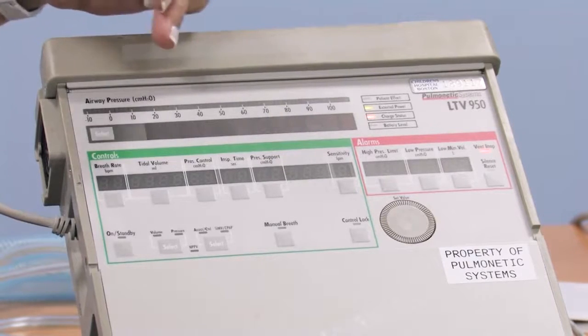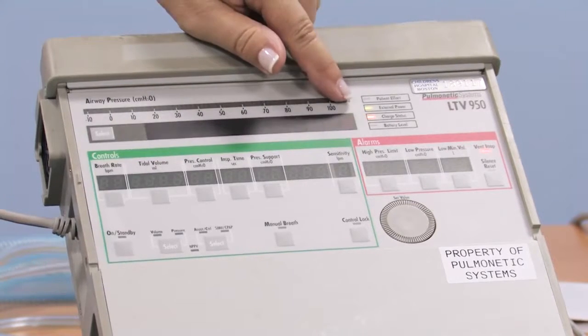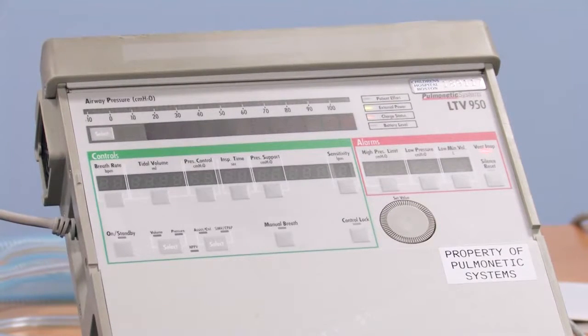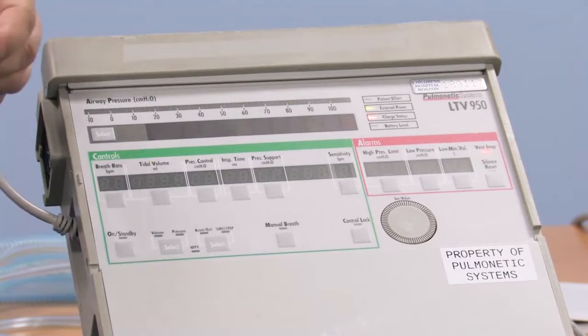It will alarm bat low and bat empty to alert you that the power source it's on has either gone out or is running low. And the green will turn to red. But it would be helpful if you would note what time you start using your battery power, and certainly keep an eye on the overnight battery if you're ever using it in a power storm. Assure that you can hear the alarms from where you are. The Sprint Pack, which you'll see later, does have battery indicator lights on it so you can check and see how much power you have left.